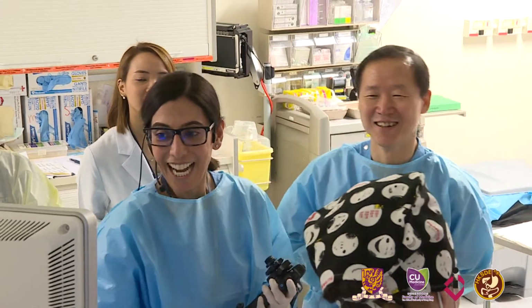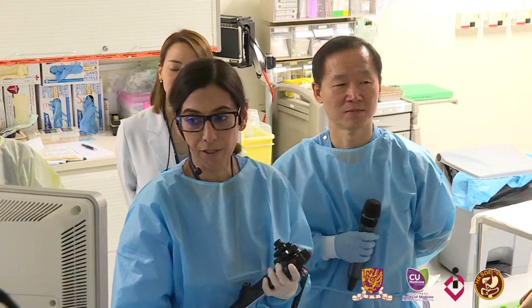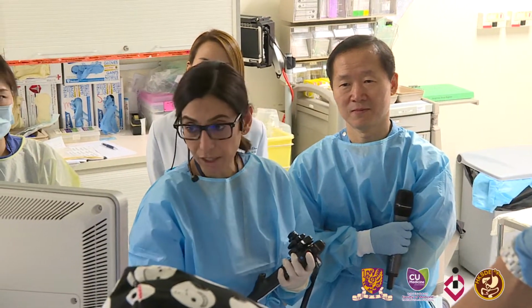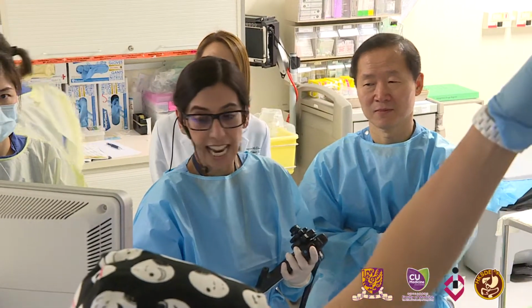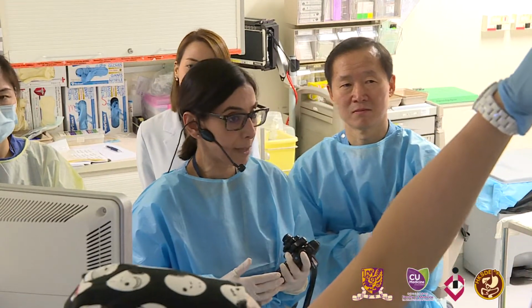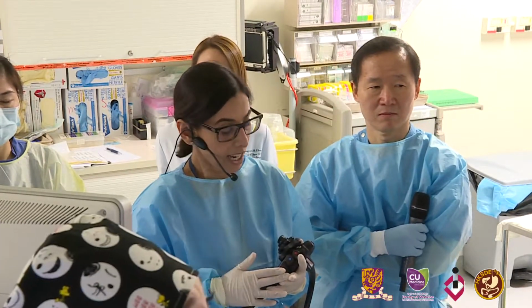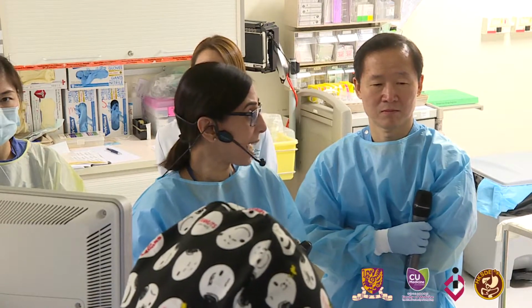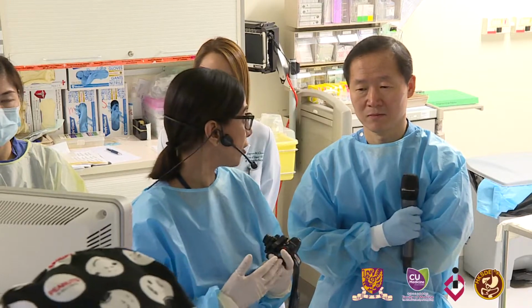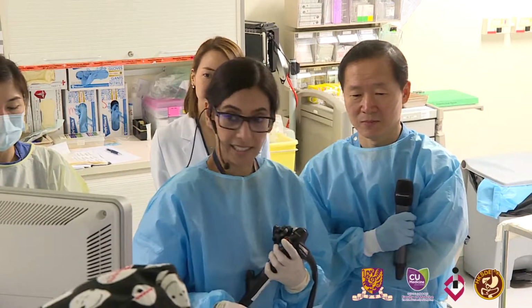to stand. Just a couple things in the presentation whenever you're thinking about the workup and differential for pancreatic cysts. Obviously, we're trying to distinguish mucinous from non-mucinous lesions. And first thing, the patient's age, 69 years old, so that could fit into an IPMN category. She's female. The location of the cyst is in the head region, and she's asymptomatic. This was an incidental cyst that's been growing in size. So perhaps this could be an IPMN lesion given all those things. And then now we'll proceed to the EUS.